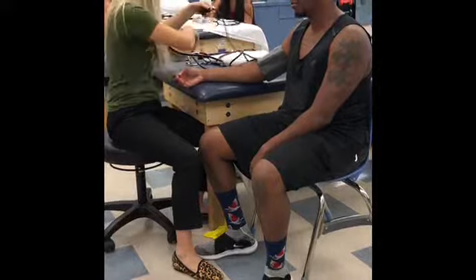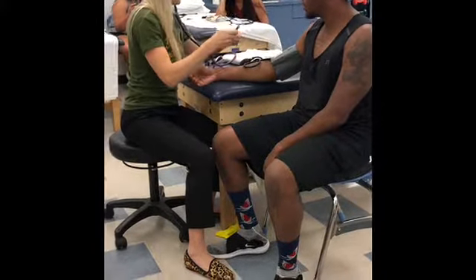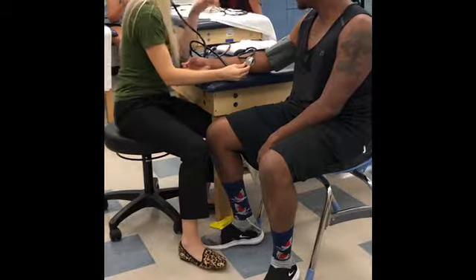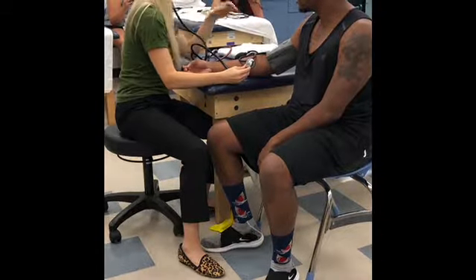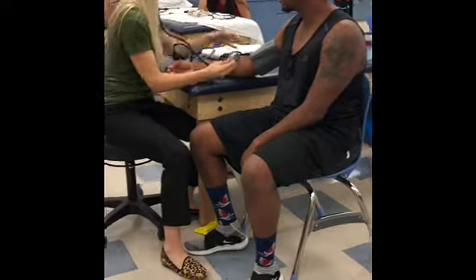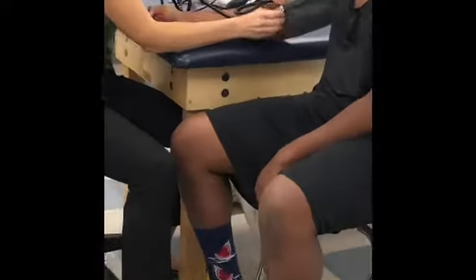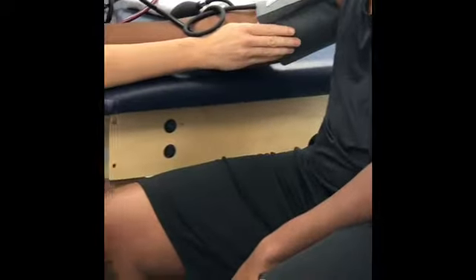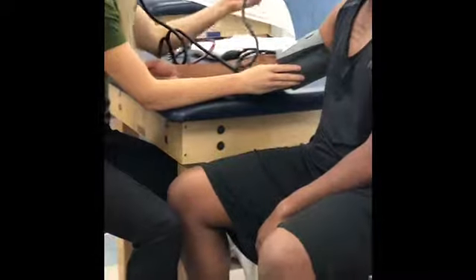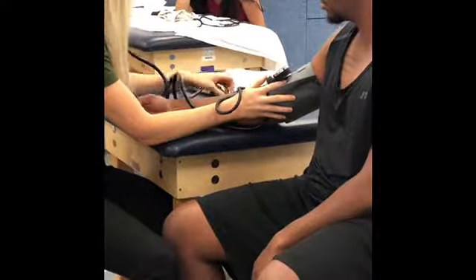Alright, so then same thing, going to check his blood pressure. You position yourself where it's comfortable for you. Dr. Reed and I will work around that. If I need to come lay behind him on the table to see it, it's fine. You get comfortable where you need to be. For me, I'm going to be right here in front of Q. I can see it. We'll move this or position it if we can't see it from where you guys are doing it.